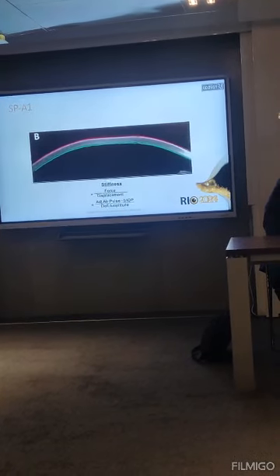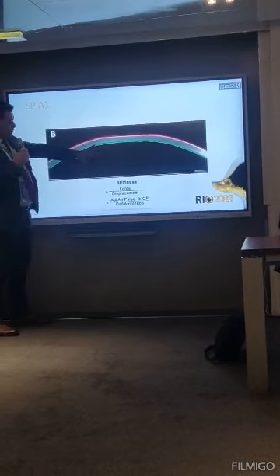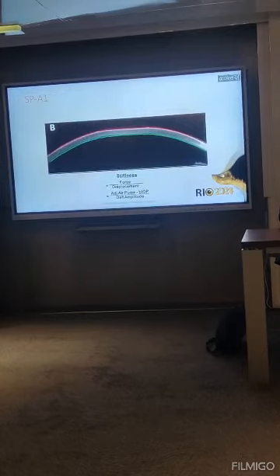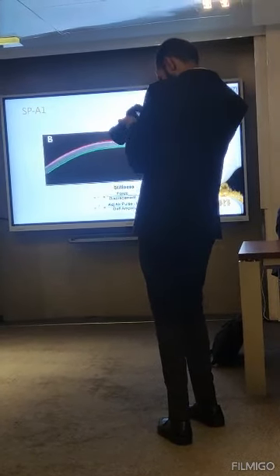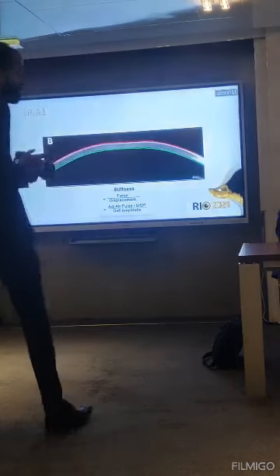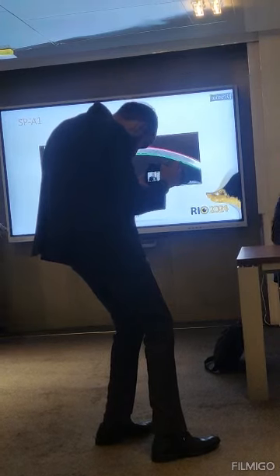The SP-A1 is one of the most important parameters because it compensates for the intraocular pressure. We always think about the intraocular pressure. If the intraocular pressure is very high, the cornea will not move inwards because of the intraocular pressure, not because of the stiffness of the cornea. So we have to adjust for the intraocular pressure. In stiffness parameter A1, this is the work of Cynthia Roberts, by the way, she compensates for the intraocular pressure, or the biomechanical intraocular pressure. This is why it's at applanation 1, where the intraocular pressure is measured.